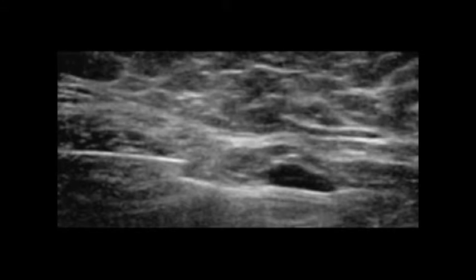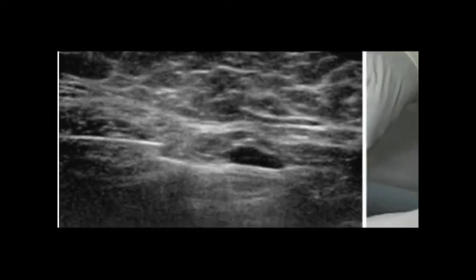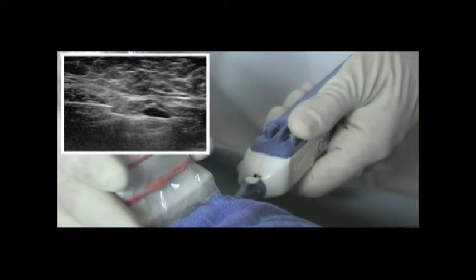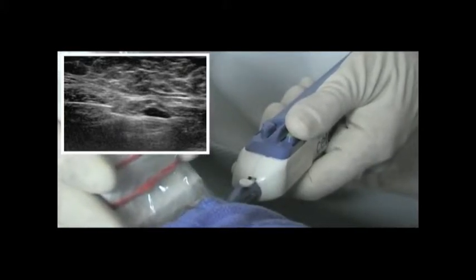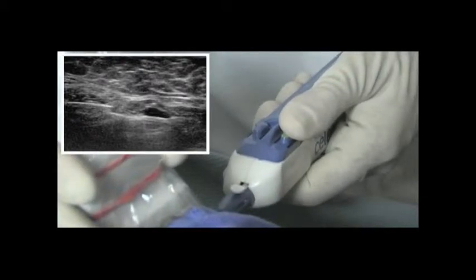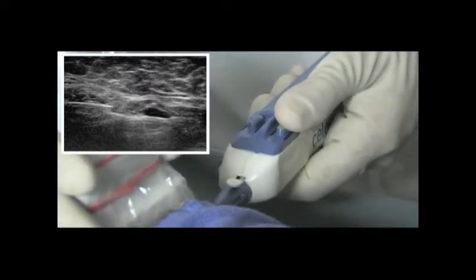Ultrasound-guided breast biopsy is typically performed to sample palpable lumps and fibroadenomas, and is clinically proven to be an effective biopsy tool for dense breast tissue. Spring-loaded core retrieval is widely used in ultrasound-guided breast biopsy today, with more than 550,000 procedures done annually.